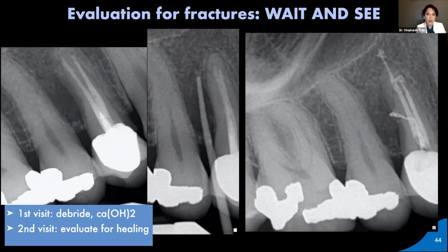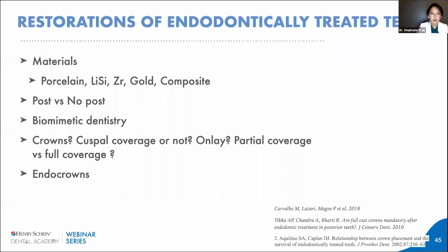So when I completed the root canal treatment, I could see that there was actually a lateral canal right into the middle of the radiolucency. So that confirmed that even though this had a lot of signs that could have told me that maybe there was a root fracture, not only could I not visualize one or confirm one, but that radiolucency was almost like a red herring. It's actually due to a lateral canal that just got big enough due to enough bacteria and chronic abscess. And it actually wasn't a vertical root fracture. So because there was healing, the patient was now asymptomatic, we could have a much better prognosis. So right into the middle, very pleasantly surprised.